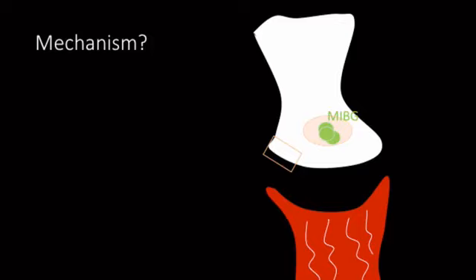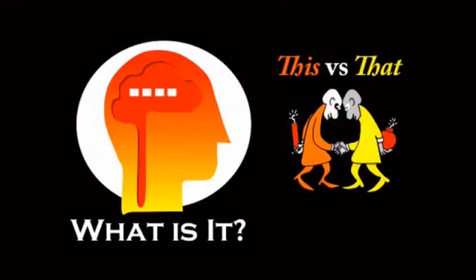Here's a piece of trivia also. The uptake is proportional to the number of storage granules within the tissue. So more storage granules, hotter uptake. Less storage granules, less hot uptake.